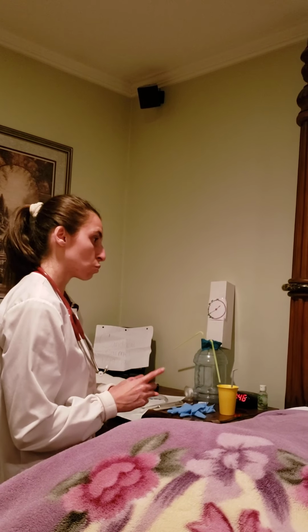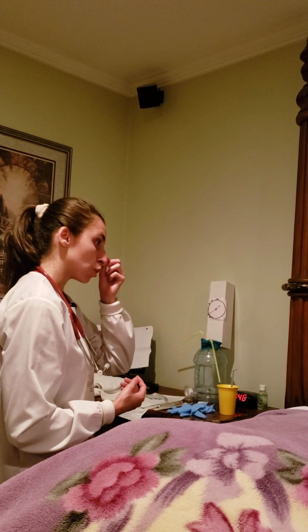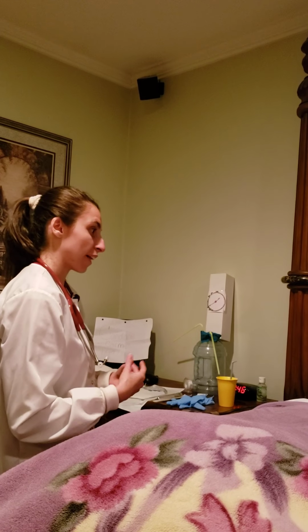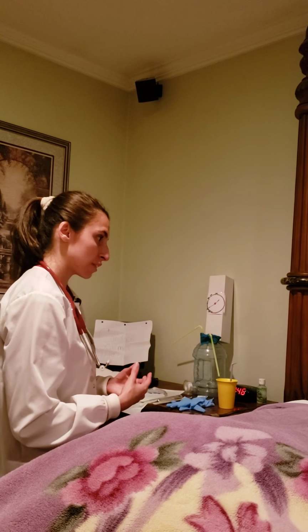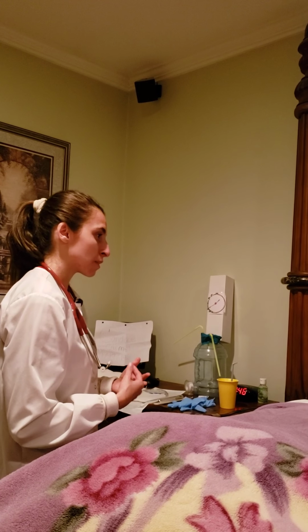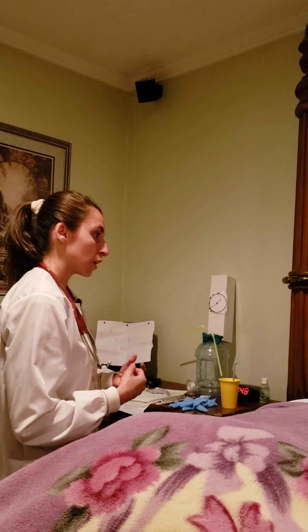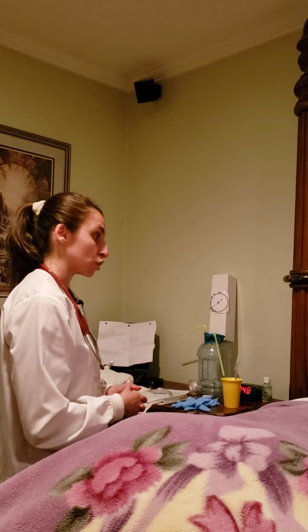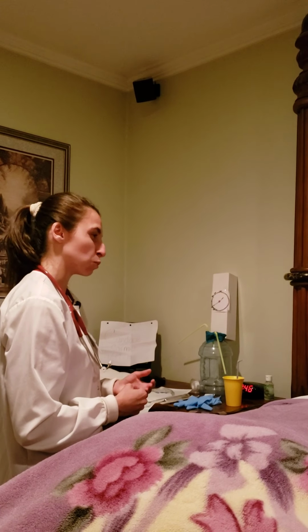So some complications will include loss of skin integrity, because since this tube is taped to your nose for an extended period of time, there may be some friction, and that can cause loss of skin. And ways that I can prevent this from happening is that I will do daily skin assessments, make sure there's no redness or inflammation, and I will put some lubricant onto the NG tube before I insert it into your nose, so the NG tube can slide in more smoothly.